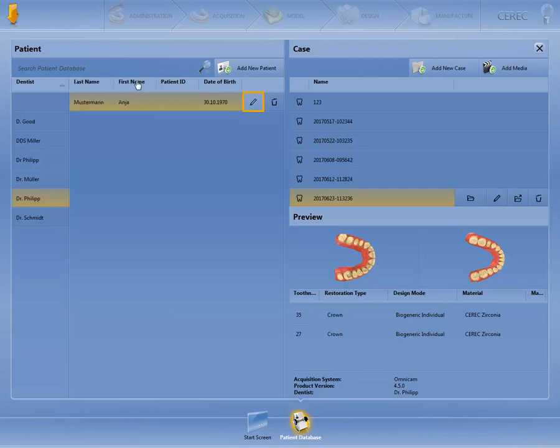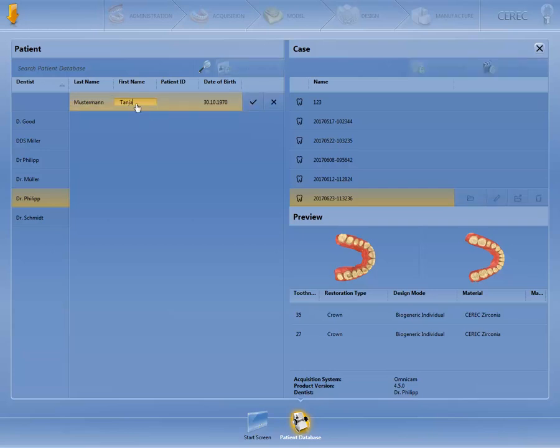You can edit the patient data using the pencil symbol. Discard any changes by using the X symbol. Click Save to save the changes.